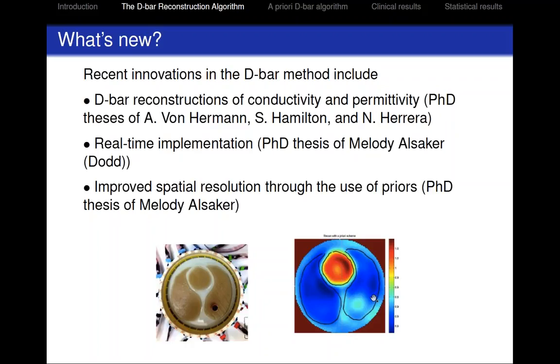So in this quick figure, what you see is a regularization method that used the spatial information of the heart and lungs, perturbed a little bit, and taken from this photo. No information about this inhomogeneity in here, which is a copper pipe, and yet it sharpened the image in this way. In this slide, I don't have the original reconstruction, but in the original reconstruction, it's more blurred than it is here. And yet, even without the a priori information about the copper pipe, it shows up nice and clear, pretty clear.